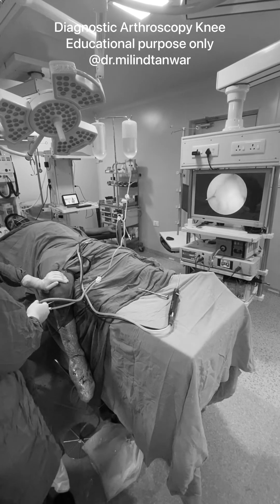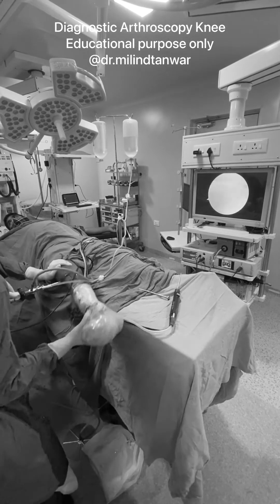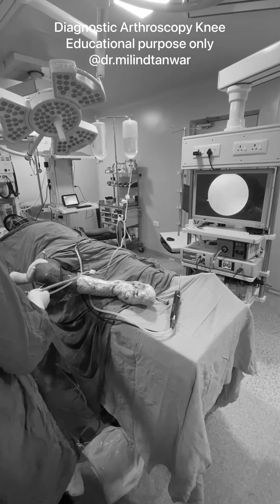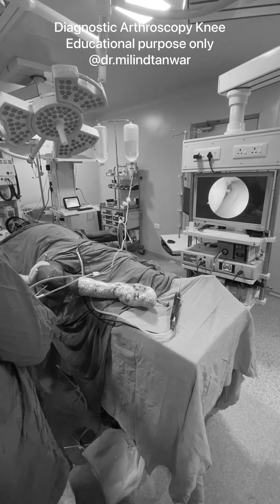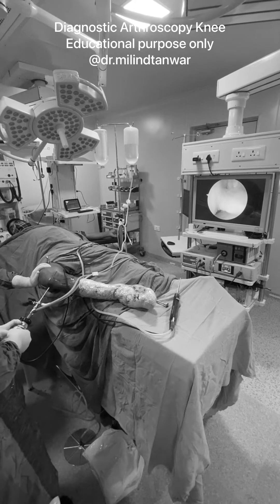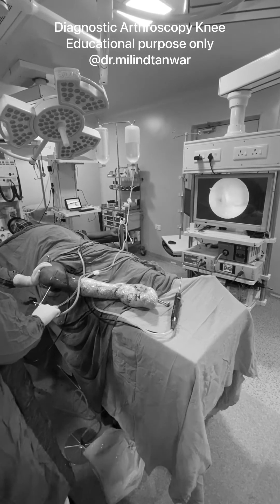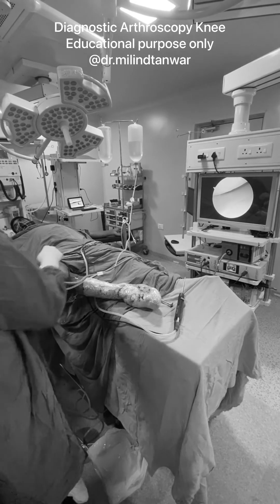To see the lateral side, go to the lateral side and do a figure-of-4 position. Keep your assistant by your side to help. If you get lost, try to go directly to the notch first. Once you see the notch, you see the ACL attached beautifully. You can see the ACL and the PCL in a figure-of-4. Then you can go inside and see the lateral compartment.